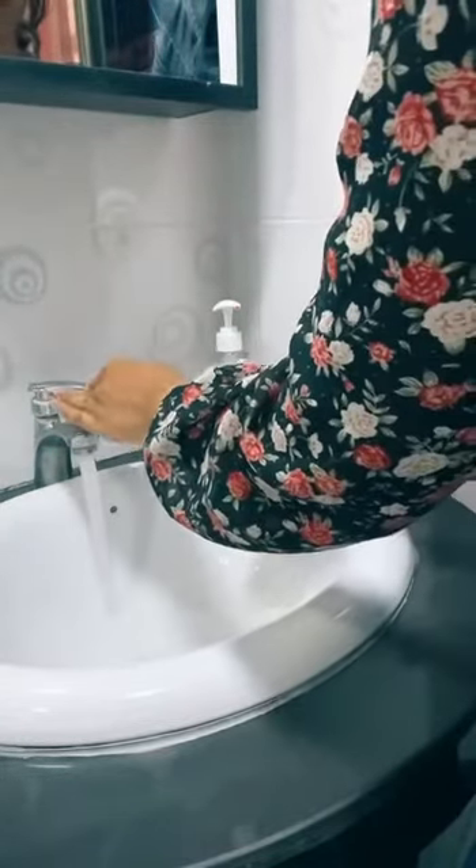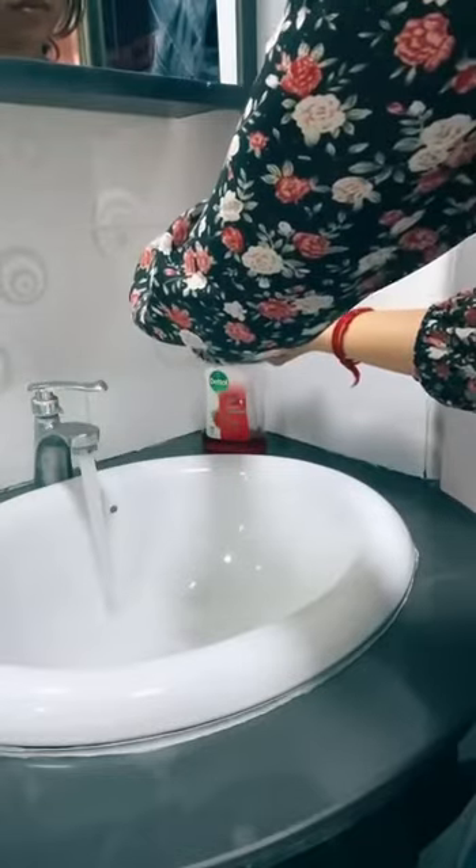Good day! Today, I will be showing you how to measure oral, axillary and temporal temperature. First, start by washing your hands properly. Sanitation is an important step when it comes to measuring temperature.